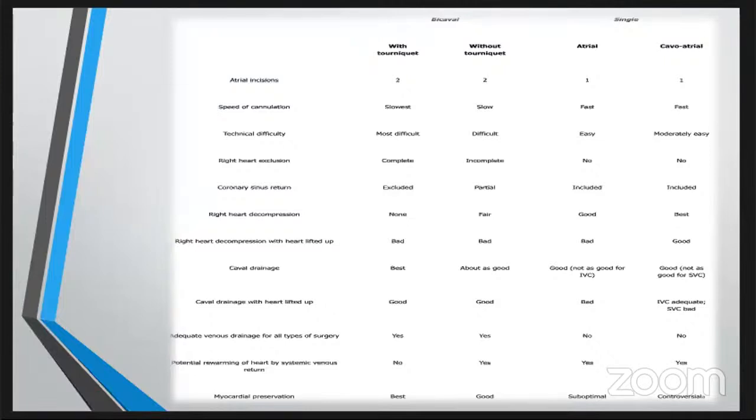And finally, in case you need a retrograde coronary sinus cannula during CABG or AVR, you can snare and open the atrium and place it directly if the blind approach is difficult.